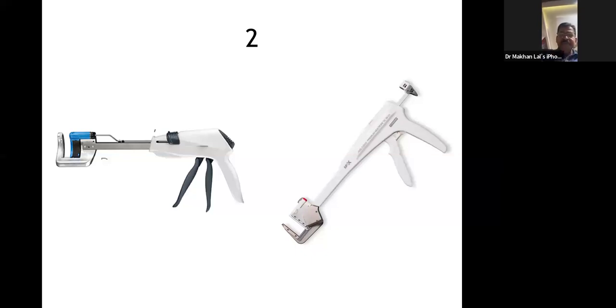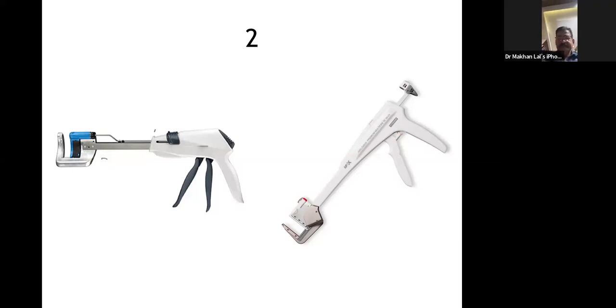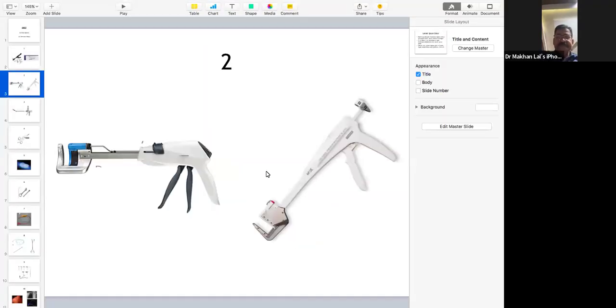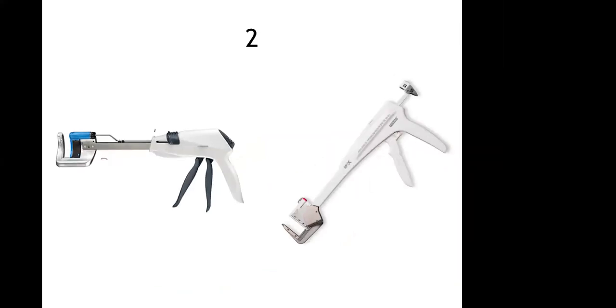Do you need to clamp the proximal side of the gut? Yes, sir. Otherwise, there will be spillage. Okay. So you have to apply a clamp proximally to prevent spillage, and then you can use a linear cutter or even scissors to cut.